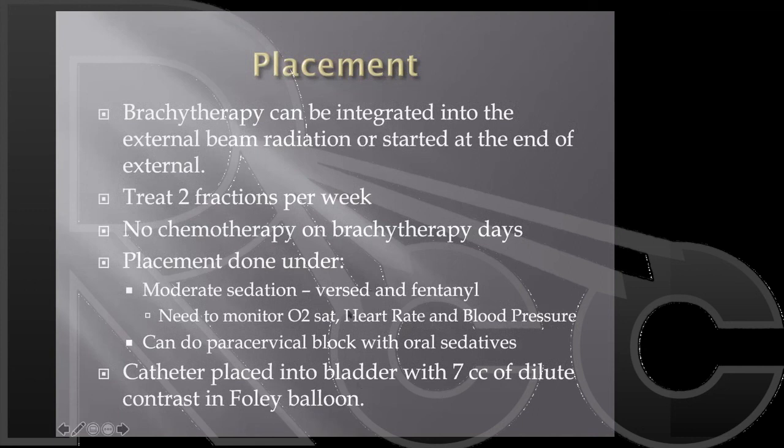The other advantage of Versed is it causes amnesia. So when patients come back for their second fraction, they don't have this traumatic memory from the first fraction. They don't remember any of the prior placement. A catheter is placed before we place the devices. We always use 7 cc's of dilute contrast in the Foley balloon.